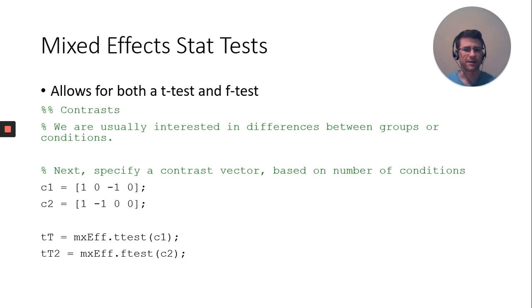Here's how you run the t-test. You do mixed effects dot t-test, put your contrast in, save as an output variable. For the f-test, replace the t with an f.